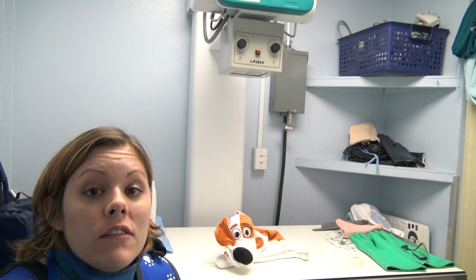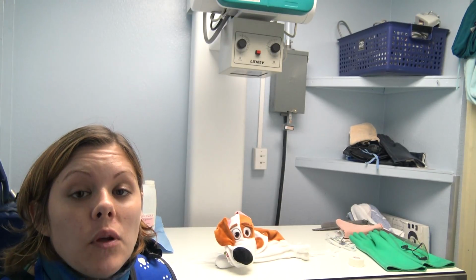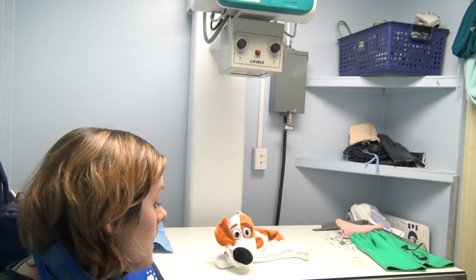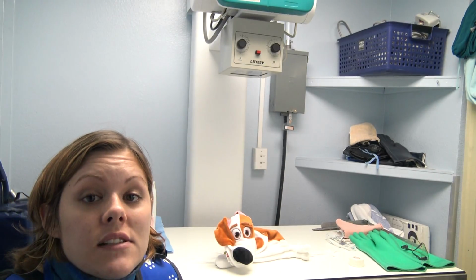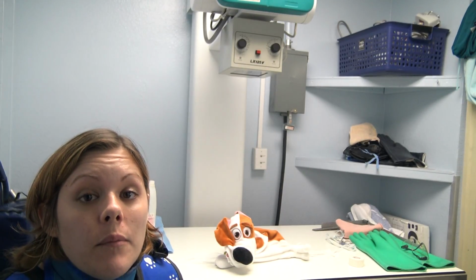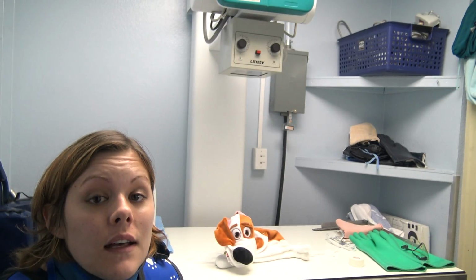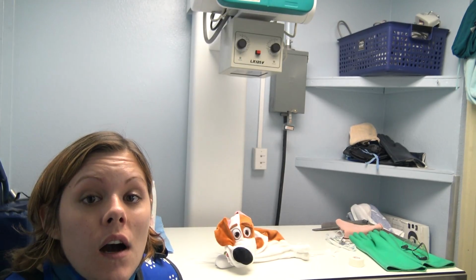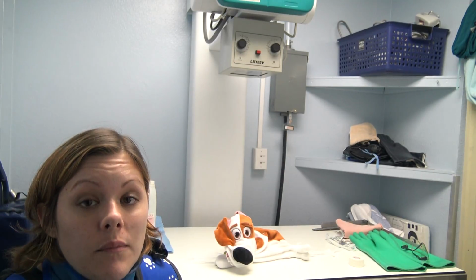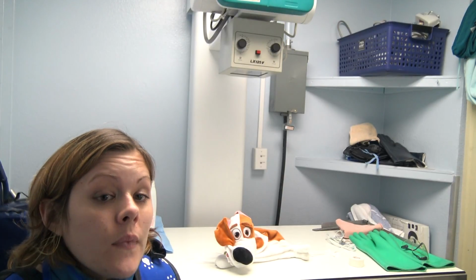You want them fasted for about 12 hours, which is ideal, or 24 if you're looking at the mucosa, or the lining of the stomach or intestines. Contraindications, or where you wouldn't do a barium study, would be a fluid-filled or distended esophagus or stomach, or ileus due to torsion. If the bowel is atonic, or lacks muscular tone, those are also reasons not to do a barium study.